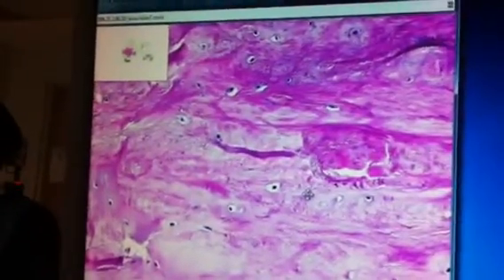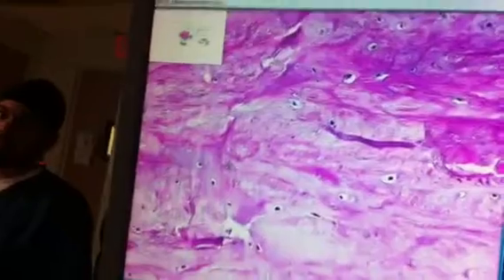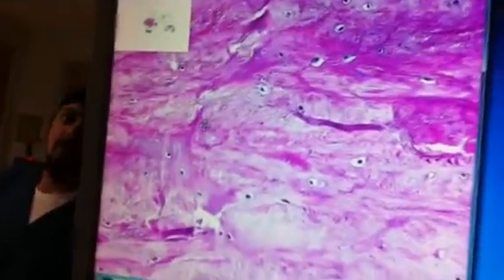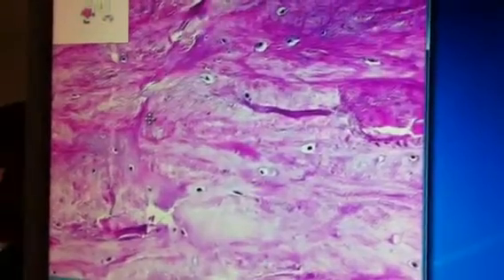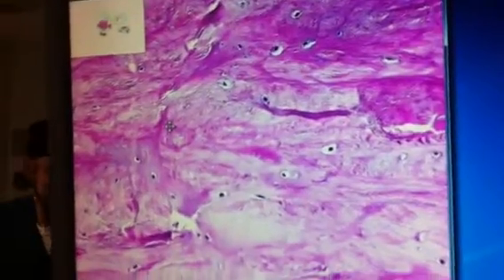Why are they so hard? What that would tell me is that this is a fairly quiescent tissue, that it's not actively growing. And if you see it coming from intervertebral discs, perhaps, you probably wouldn't see that many.